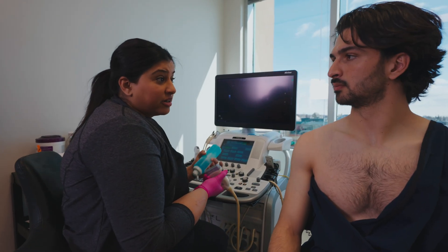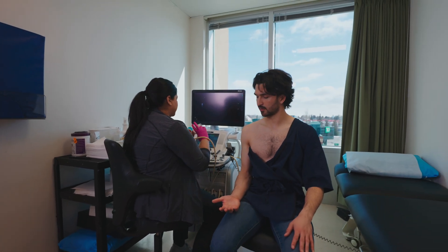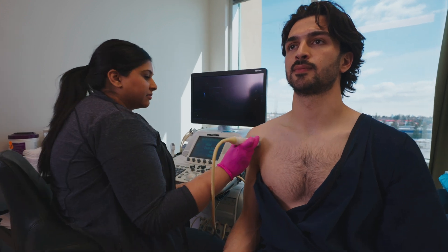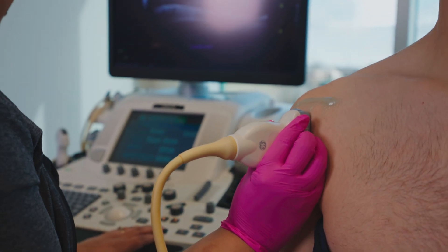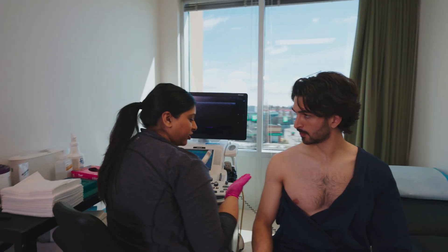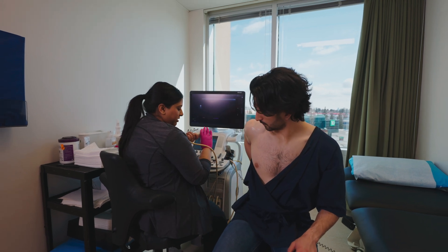So I'm just going to get started. I just want you to flip your palm up, bring your elbow back a little bit, and just stay nice and relaxed for me. All right, Marco, what I need from you now is I need you to take your hand, place your palm on your lower back as if you were going to reach into your back pocket. Perfect.